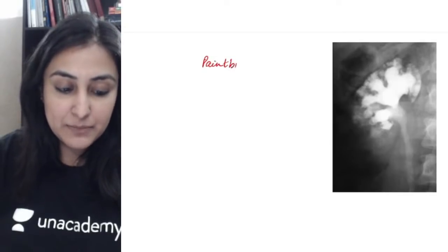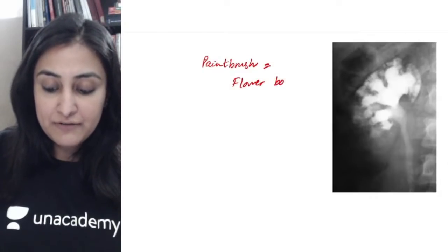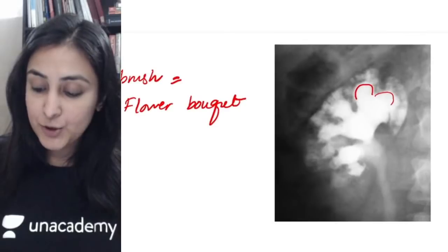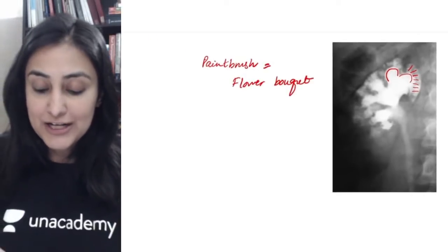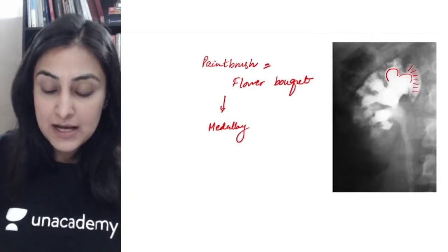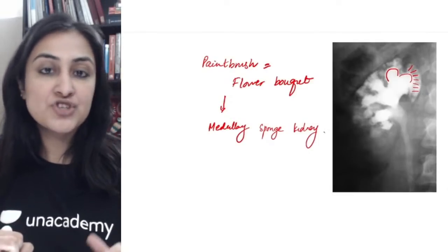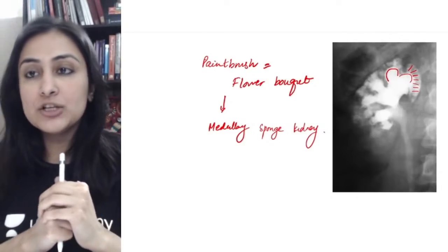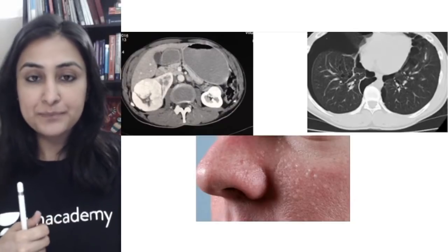Next image shows a very typical paintbrush appearance, also likened to a bouquet of flowers. In the medullary pyramids there are striated white calcifications. This is associated with medullary nephrocalcinosis, typically in a disease called medullary sponge kidney. This is medullary sponge kidney disease where you have this striated calcification along the medullary pyramids — called bouquet of flowers appearance.